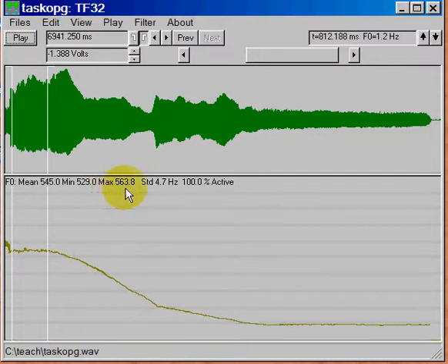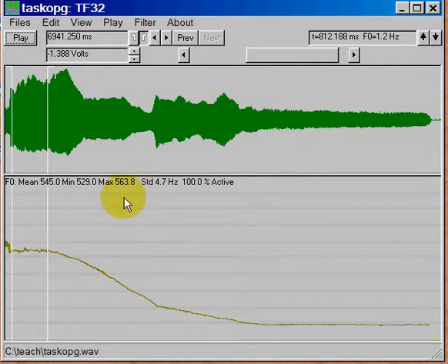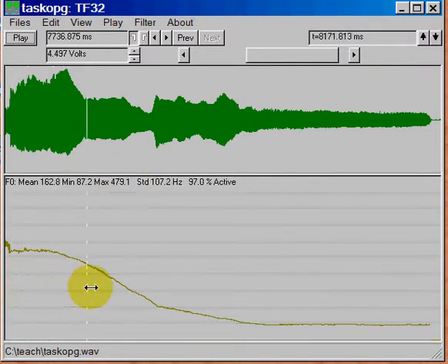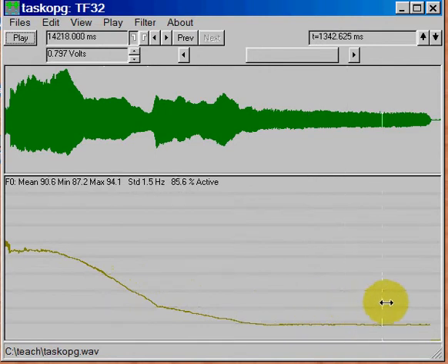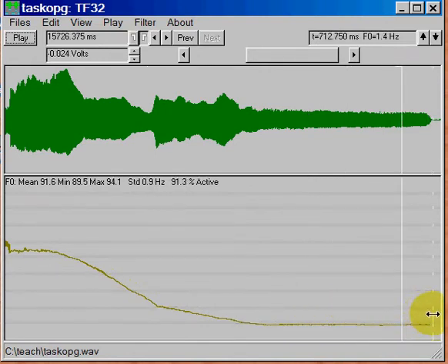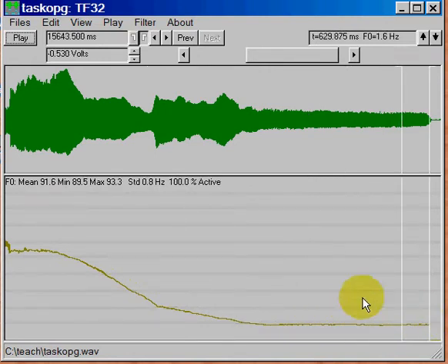And so we're looking for the maximum value, 563.8 hertz. So we can just round it to 564 hertz. That was my highest value. And that's going to be my maximum F0.